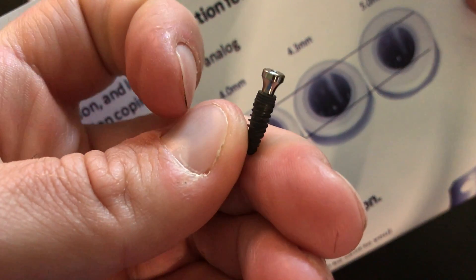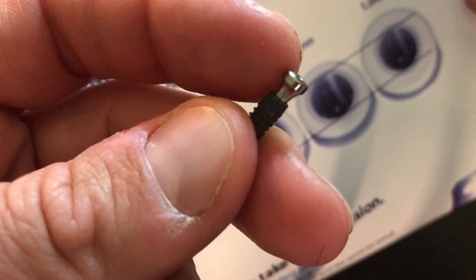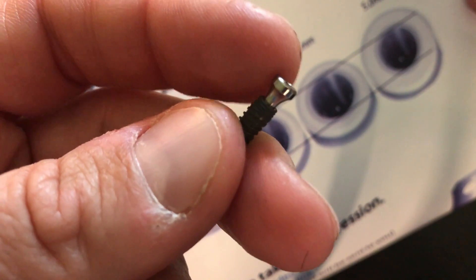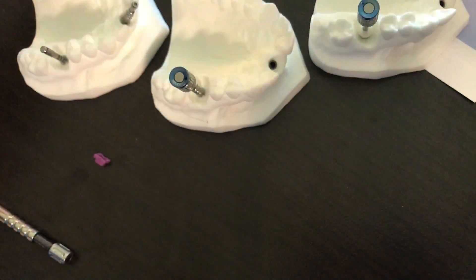I'm showing everybody quickly how to restore the Neodent Cone Morse connection. The beauty behind this system — healing abutments, impression copings, cover screws, abutments, everything — they all have one connection on the top in the CM for ease of use.